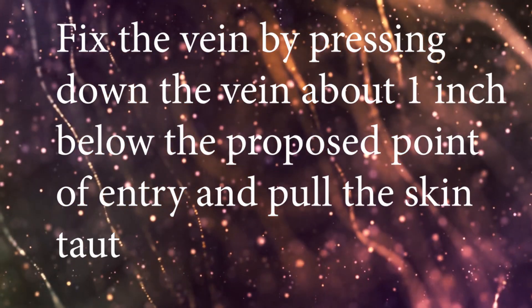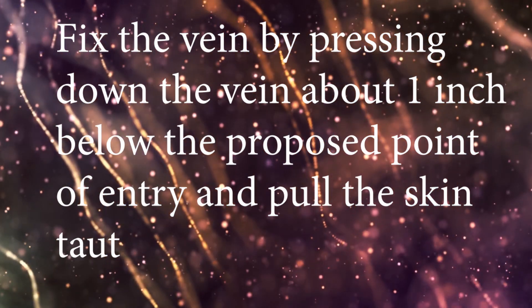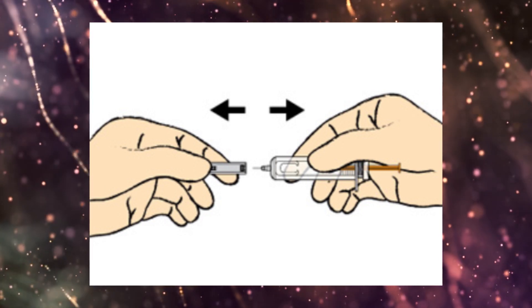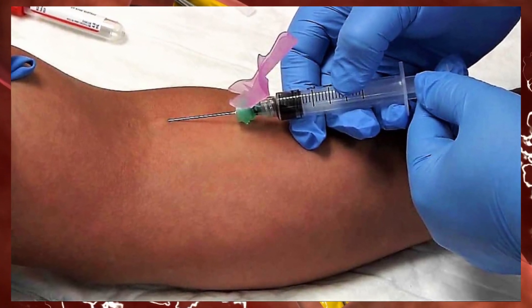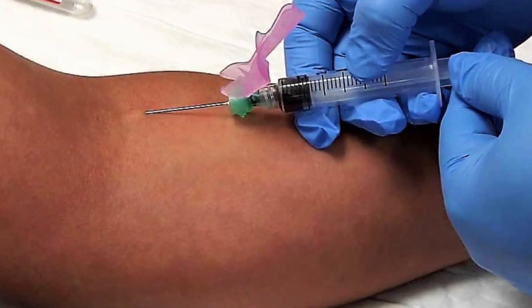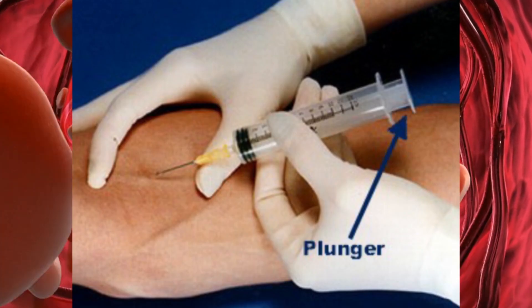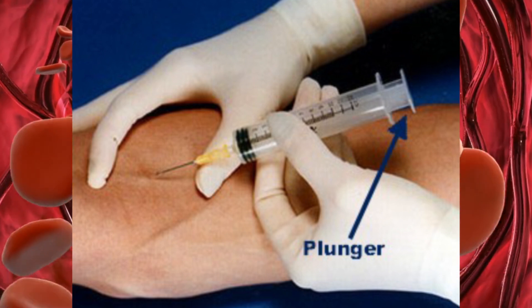Fix the vein by pressing down about one inch below the proposed point of entry and pull the skin taut. Remove the needle shield. Approach the vein in the same direction the vein is running, holding the needle at approximately a 30-degree angle or less with the participant's arm.